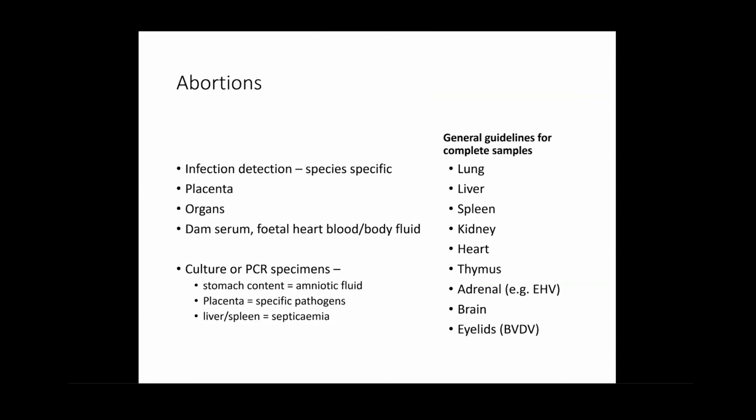You can also at the same time collect that body ooze that is around the heart. We're not going to call it necessarily heart blood. Sometimes it's clotted, sometimes it hasn't. We might be collecting pericardial fluid or just the goo that sits as we open up this liquid fetus. Collect the serum. You might not test it now, but you can separate it, freeze it, or keep it in the fridge until it becomes relevant.